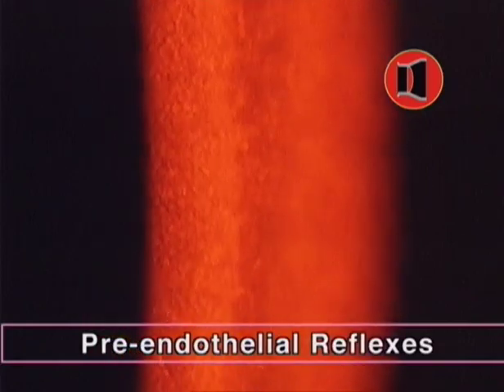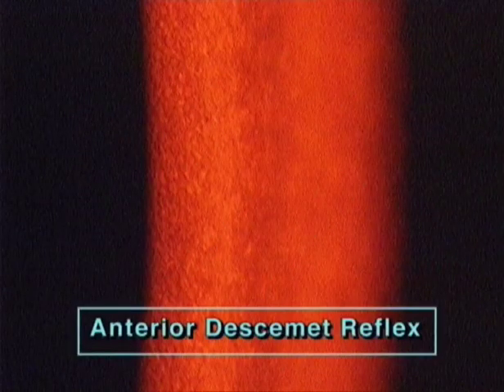Pre-endothelial reflexes. Reflexes in front of the endothelium are related to the anterior and posterior surfaces of Descemet's membrane. Both may hide the endothelium. Anterior Descemet reflex. Here, the endothelium has been veiled by an anterior Descemet reflex.